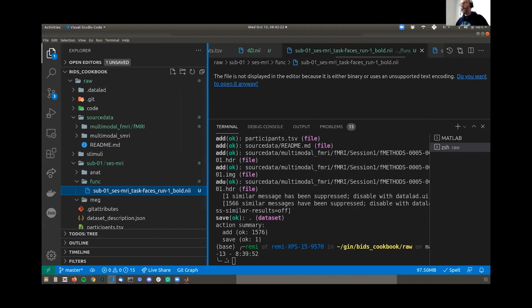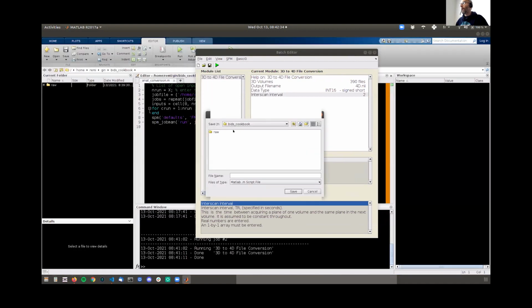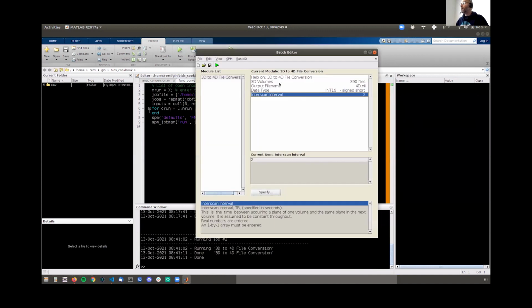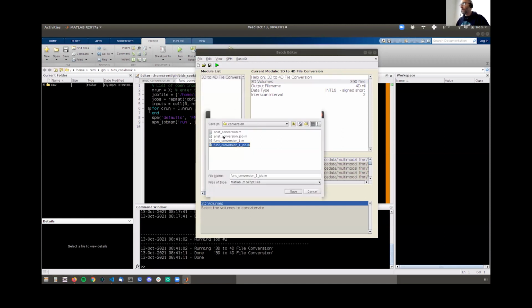Okay, so this is your first run. The second run would be much the same. I forgot to save this, so let me save that quickly. This is the func folder. Now we need to get the second session and do the same. Let's save that as well, so that we don't mess things up and we always know what we've done.